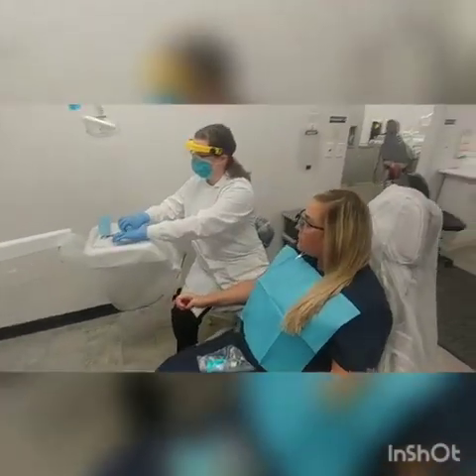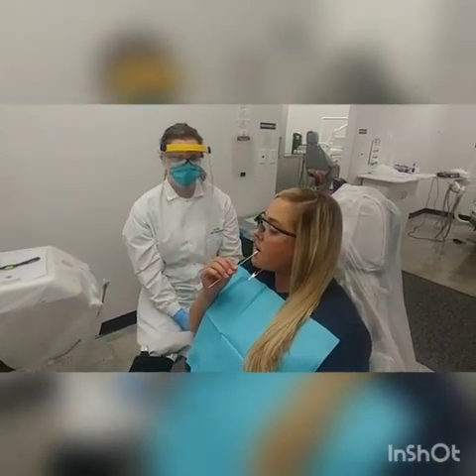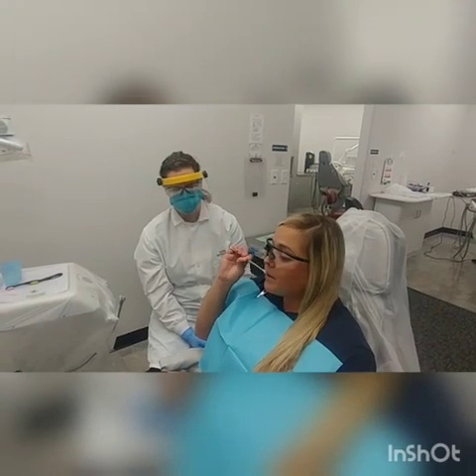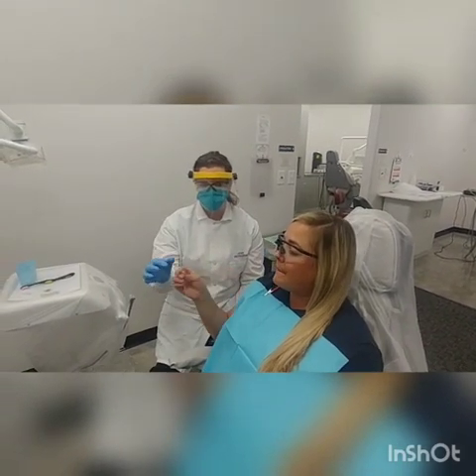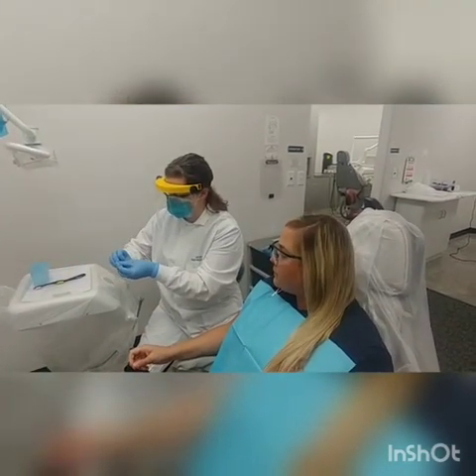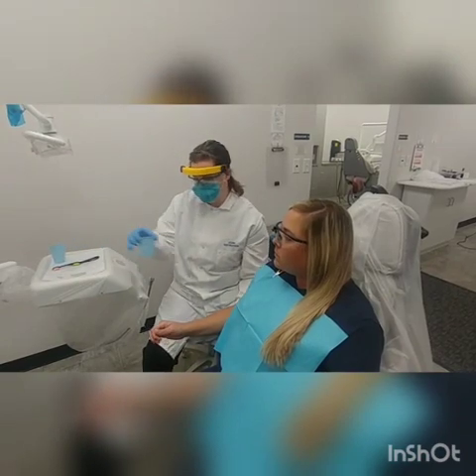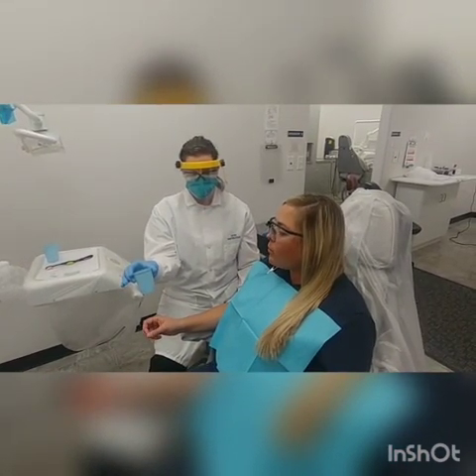So the first step is to apply Vaseline generously to prevent staining on your patient's lips. We don't want them leaving with bright pink lips. Next, we will have our patient chew a disclosing tablet and swish for 30 seconds while sitting upright. When they are finishing chewing and swishing for 30 seconds, they will spit into a cup.